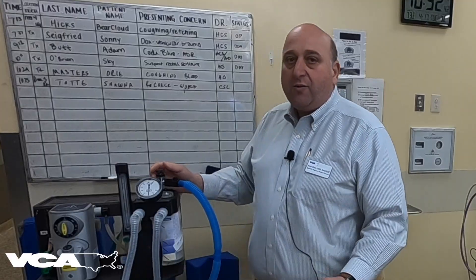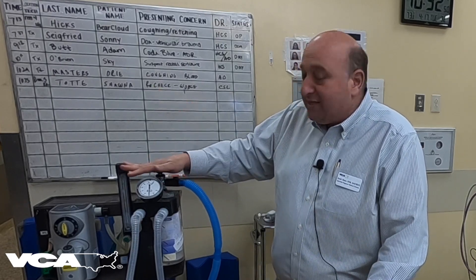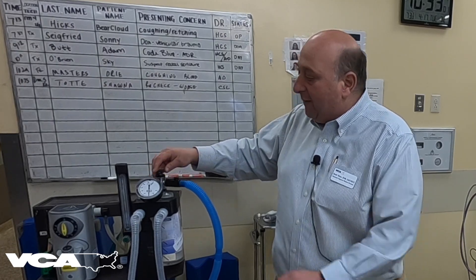The next thing you're going to want to do is close the pop-off valve. This is the one and only time we should ever close the pop-off valve, and it is imperative that when we're done with this, we remember to open the pop-off valve back up.